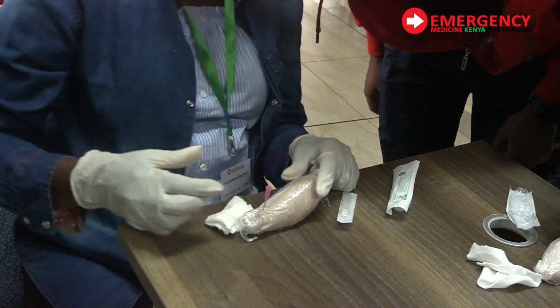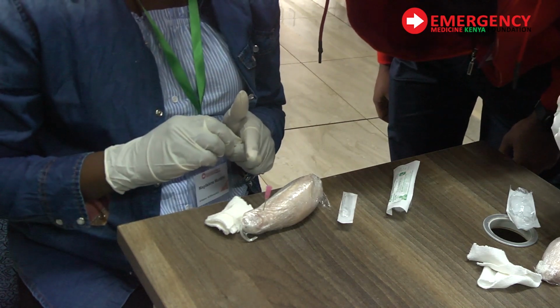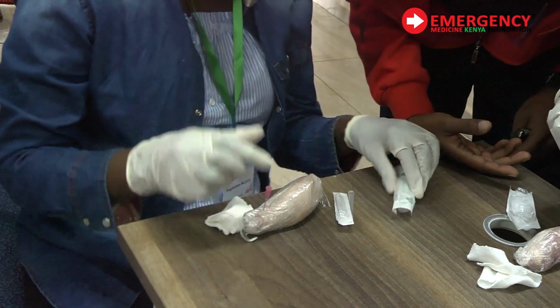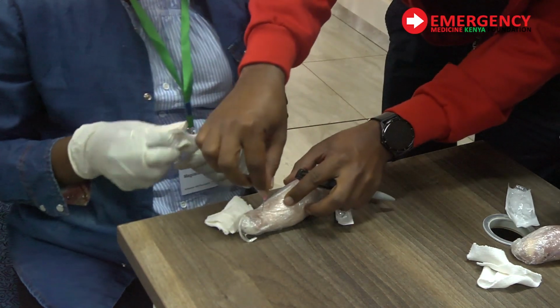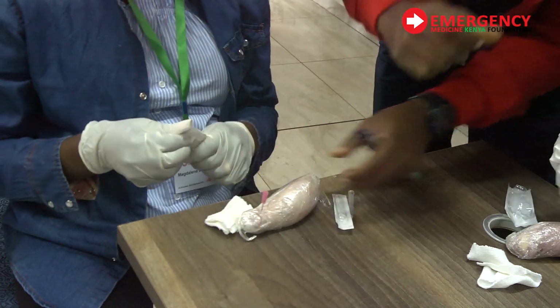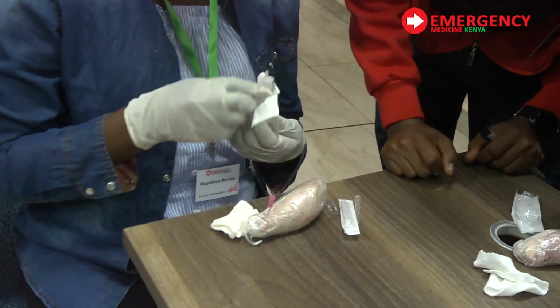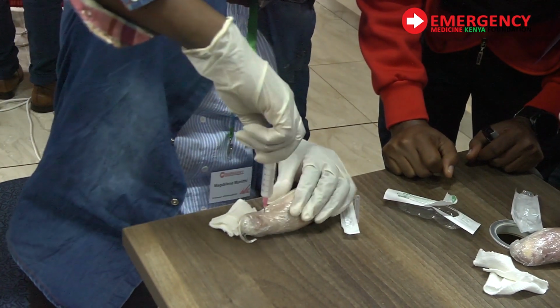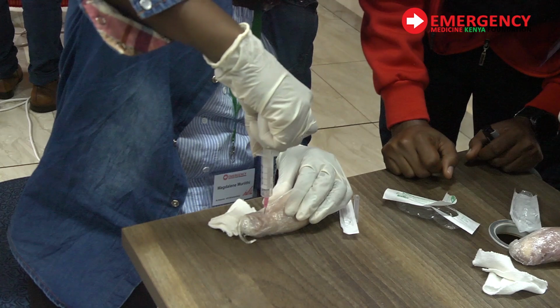As long as the bone is meant for bone marrow or you're using the bigger needle, it will just drill and go in. Remember that the surface of the bone you have chosen is a soft surface, so it will just go through. It's just like when you're doing bone marrow aspiration. It's a procedure that is done routinely. So you still pick the same sites and use that to aspirate from your bone marrow.